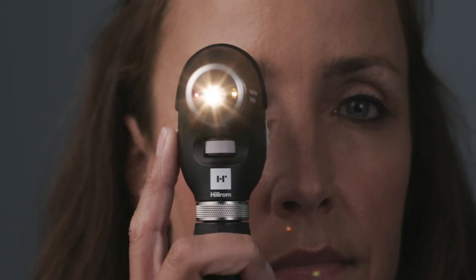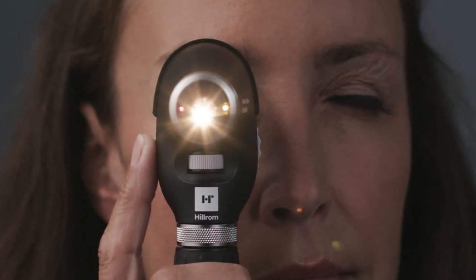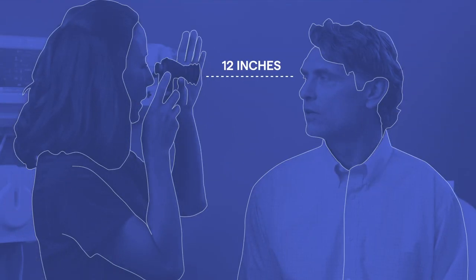Instruct the patient to focus at a distant object level with you. The Panoptic Plus features quick eye alignment, where two lights on the patient side help guide their gaze for better optic disc alignment. Have them look at the red light for a right eye exam and the lemon-lime yellow light for the left eye. Start the exam about 12 inches away at a 15-degree angle on the temple side of the patient, level with the patient's gaze.